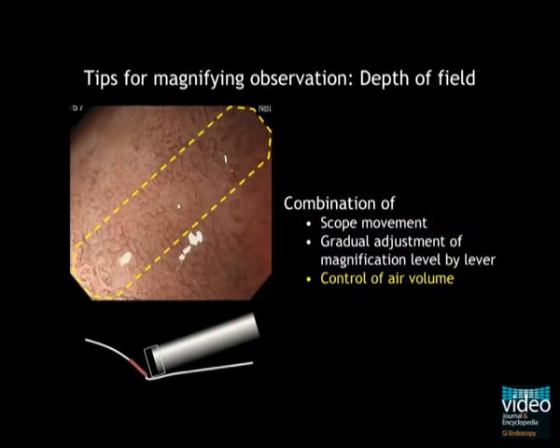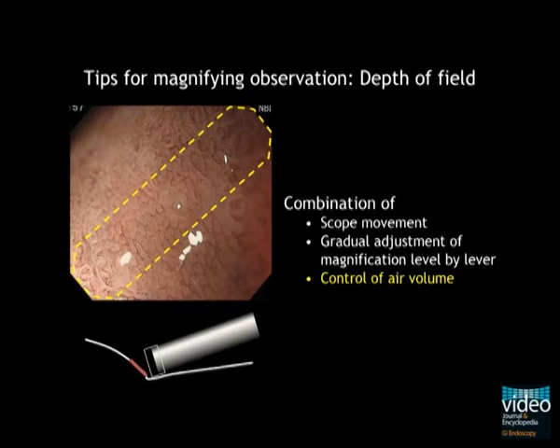Moreover, for magnifying observation, good focus can be obtained using a combination of scope movement, gradual adjustment of magnification level by a small lever, and control of air volume. Among them, air volume control is very important.